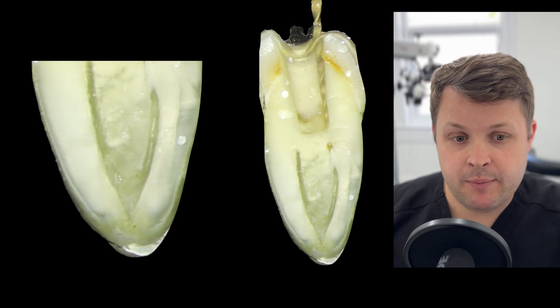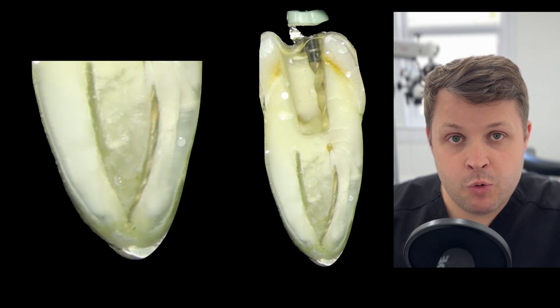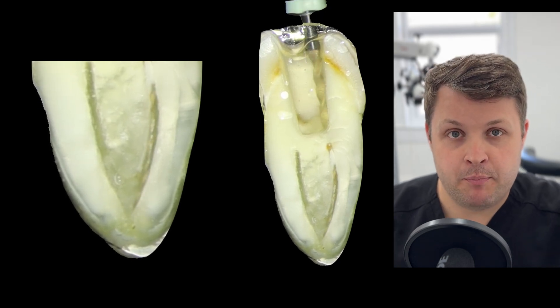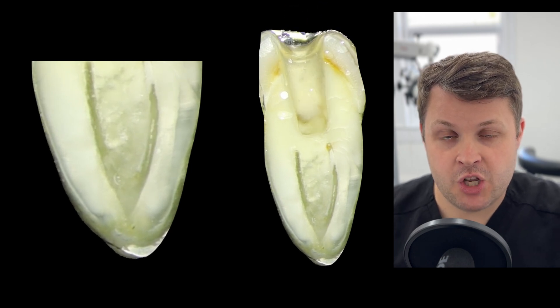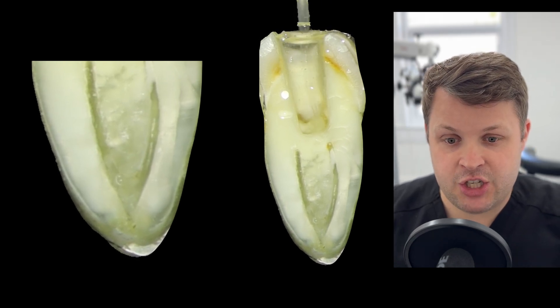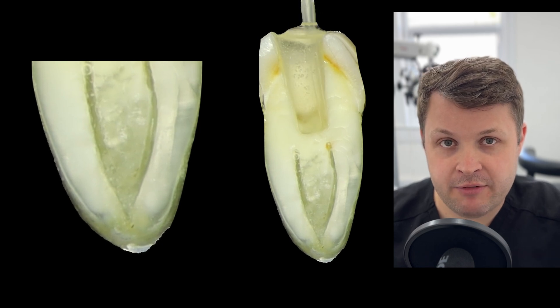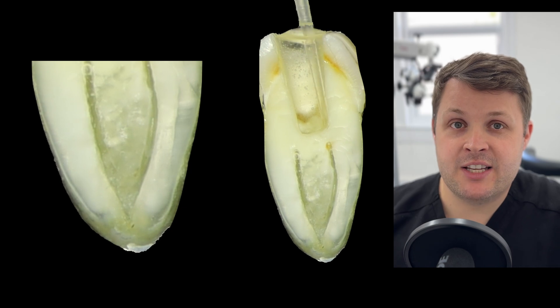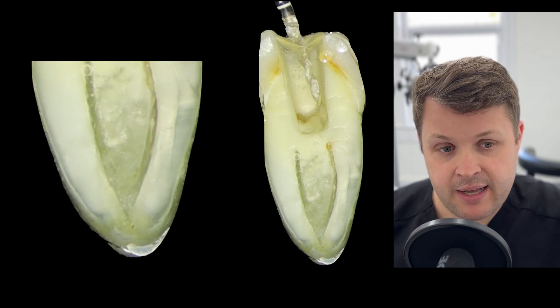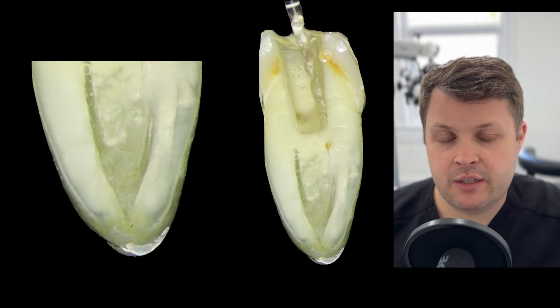The size 20 high flex isn't getting to length, so I'll use the same manual negotiation technique: take the rotary file off the motor, make a small bend in the end, manually negotiate to zero, then place it back on the motor and activate. We get past where the canal joins and moves mesially, shaping out that troublesome spot. I then try a size 25 high flex, but again it's not getting to length.